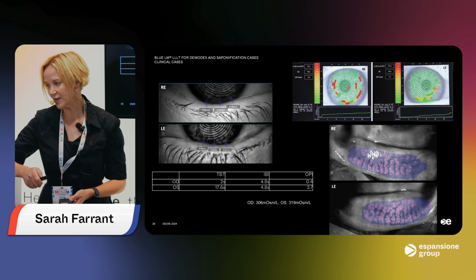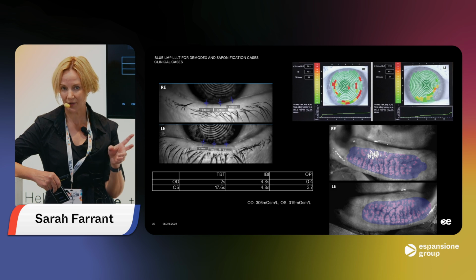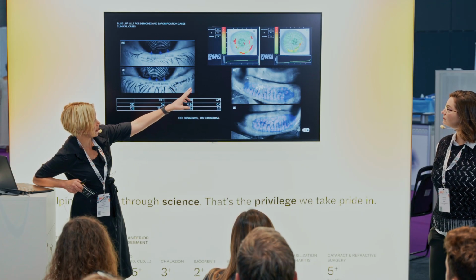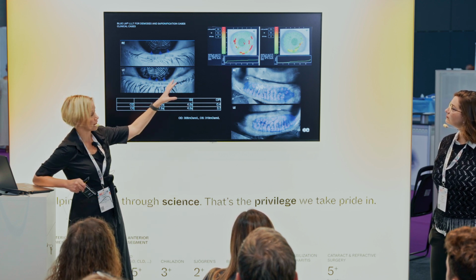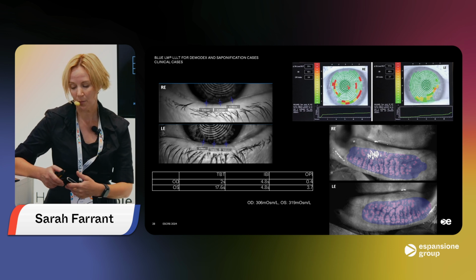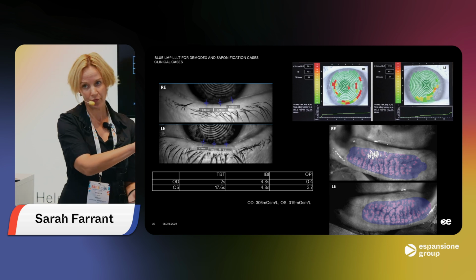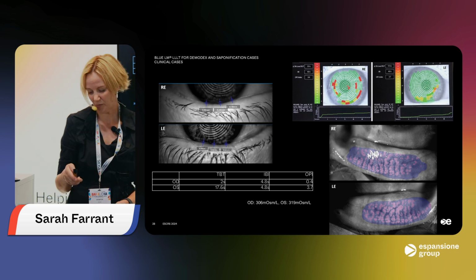So in terms of her measurements, we'd already had her on Maxitrol for a couple of weeks in that left eye with the keratitis. So her tear breakup time in that eye had already improved to about 17, 18. Her tear breakup in the right eye, which was so far untreated, was only 2. So you can see just in 2 weeks the difference that just putting her on some Maxitrol made. So clearly, a bit of antibiotic in there, a bit of steroid, and instantly we're getting a much more stable tear film. She had clearly some issues with her meibography scores, nothing too radical, but a bit of dropout there, and her tear meniscus height was fine.